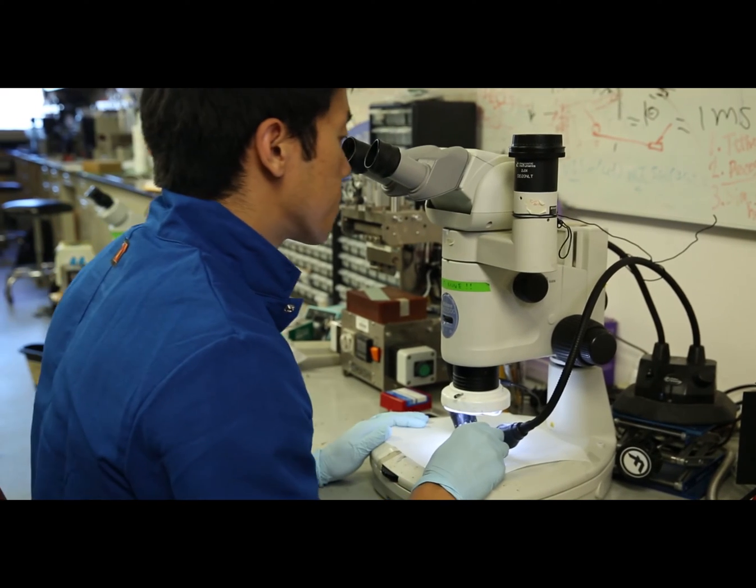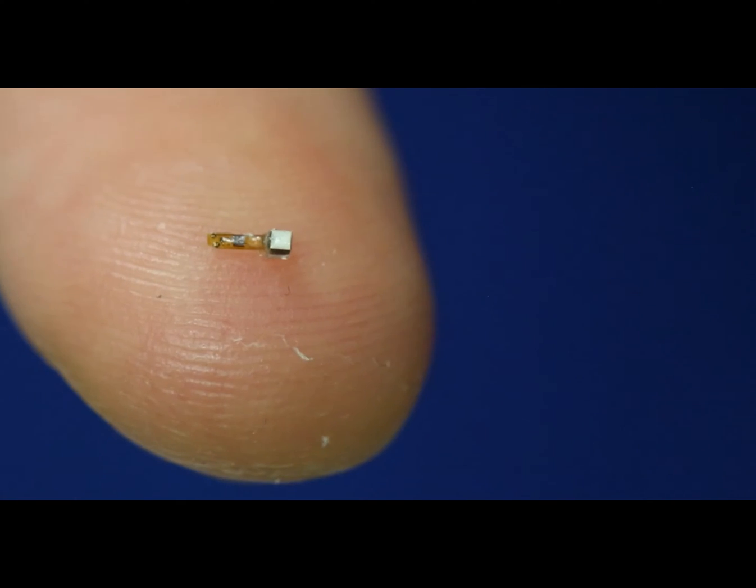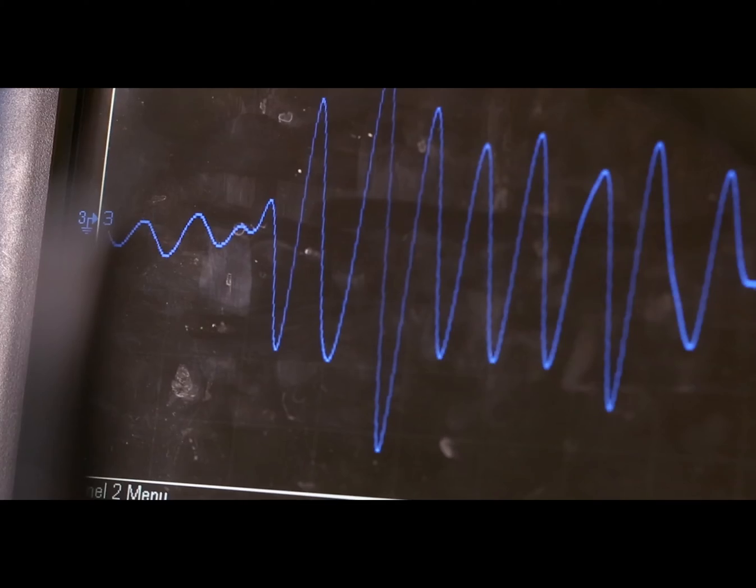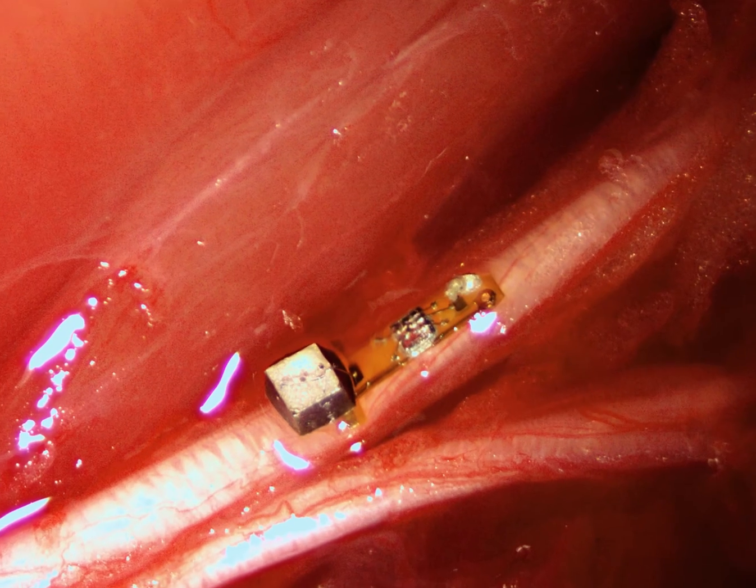The emerging field of bioelectronic medicine provides an exciting new alternative to treat neurological disorders. In this paper, we propose neural dust, which uses ultrasound to power and communicate with miniature sensors implanted inside the body.